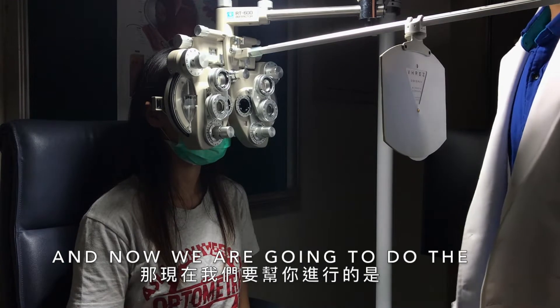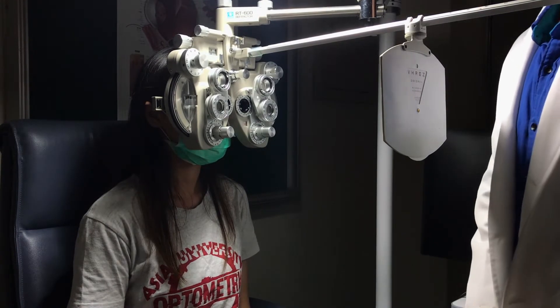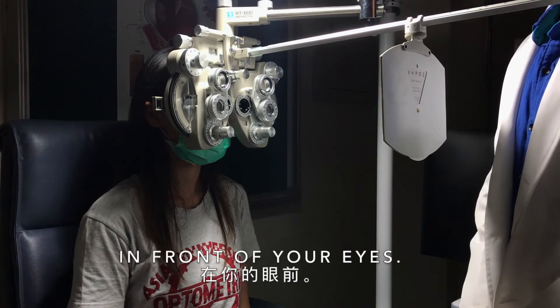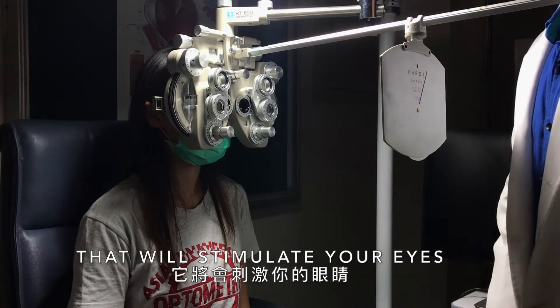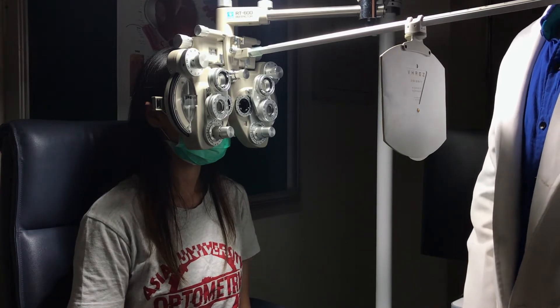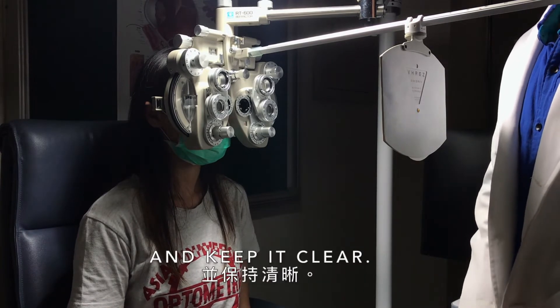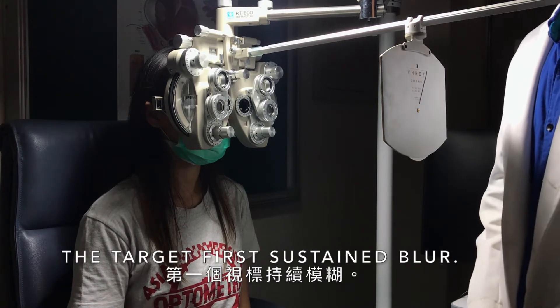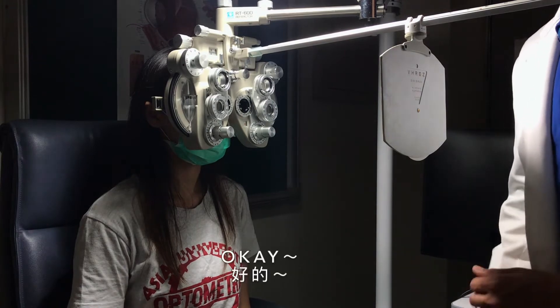Now we are going to do the negative relative accommodation. I will add plus lenses in front of your eyes. That will stimulate your eyes to relax. During the exam, please focus on the target and keep it clear. When you see the target first sustained blur, please tell me. Okay.